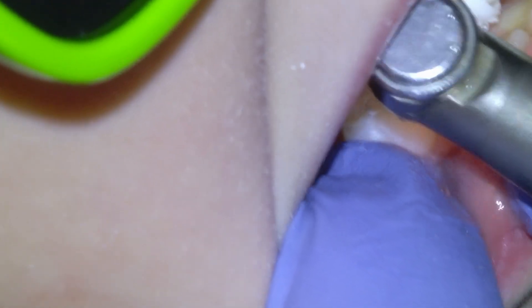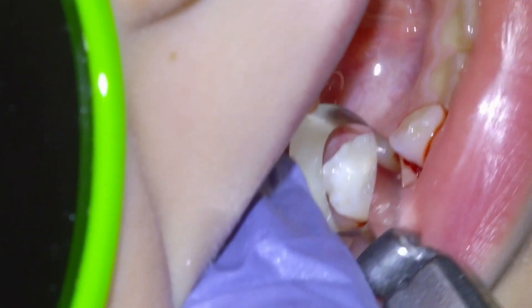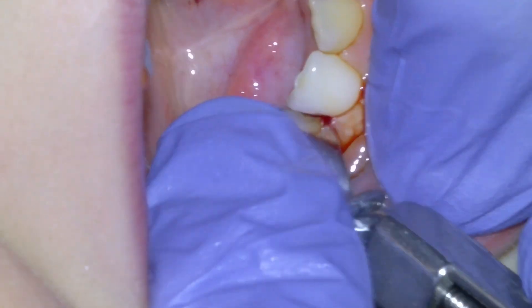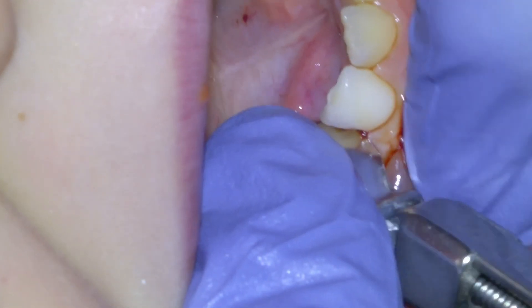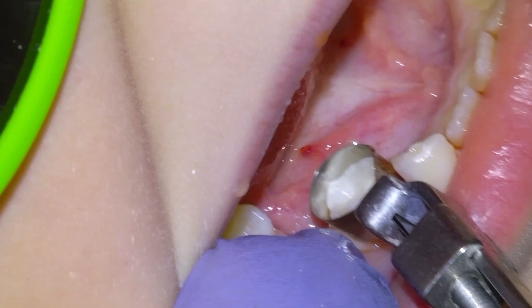Once we can see daylight between the teeth, we're going to matrix with a Tofflemire band. Sometimes I'll use a pediatric sectional and a wedge, but in this case we just cinch down a Tofflemire band and then we're going to restore the tooth.